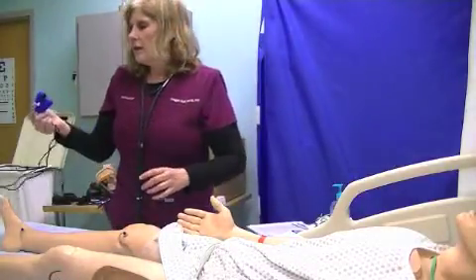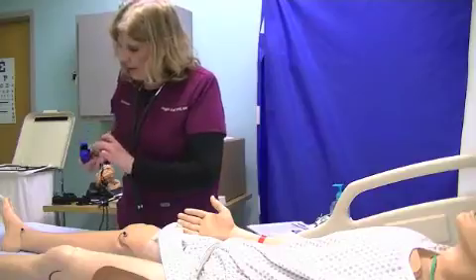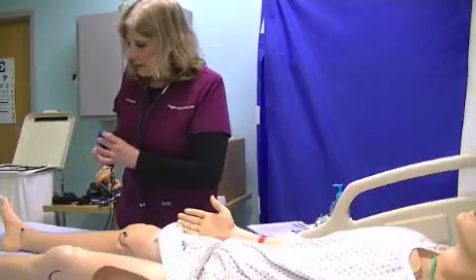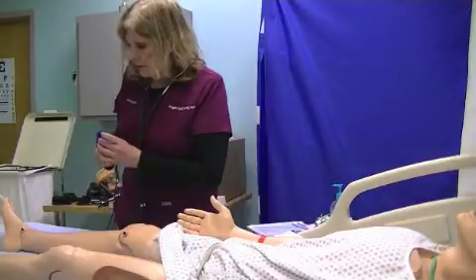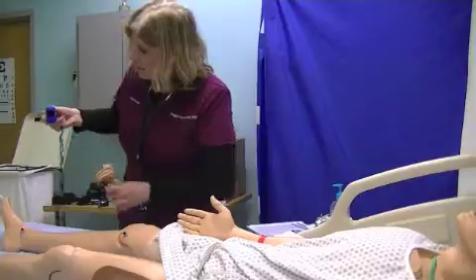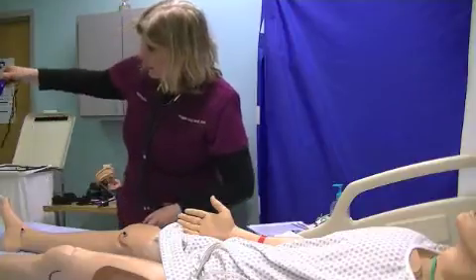You're going to clip this onto the patient's finger. This has a couple of diodes that are lined up directly. Also, between the diodes being lined up too, when you push this on, you'll see a red flashing light in here.